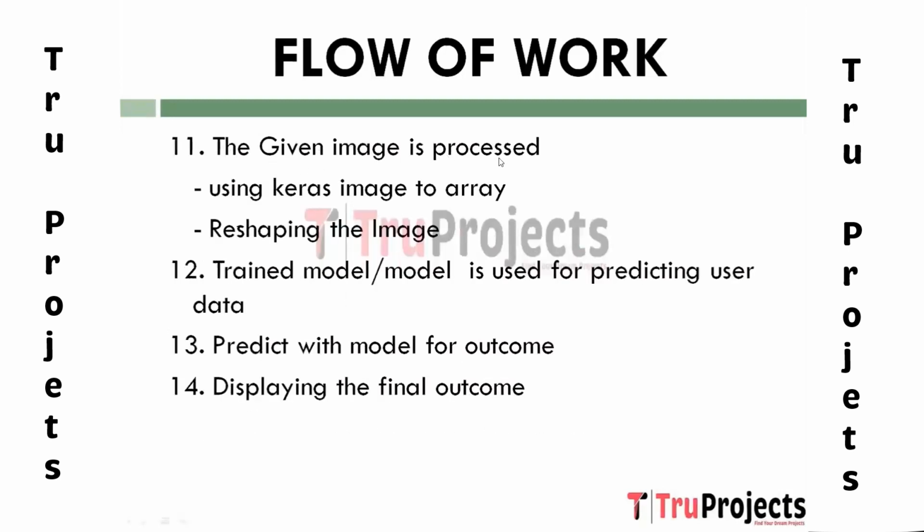Eleventh, we have the given images processed using Keras img_to_array, converting the user-provided image into a numerical array format suitable for input to deep learning models. Next, we have reshaping the image, adjusting the image dimensions or shape to match the requirements of the model's input layer.